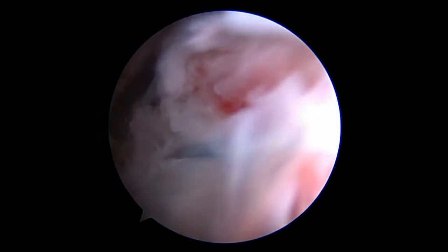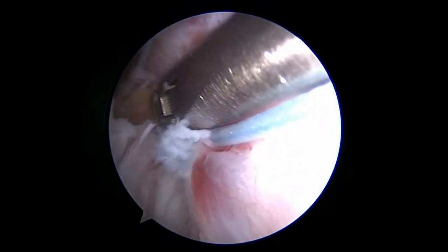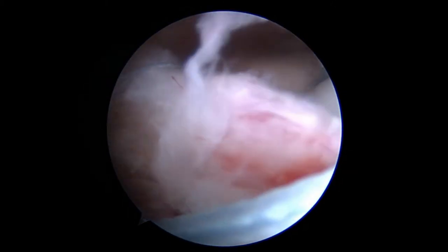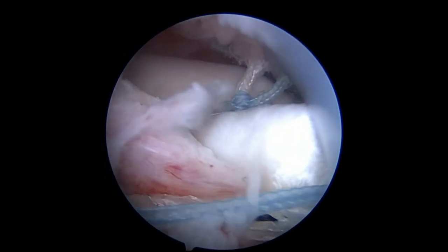The blue suture — the posterior limb from the lateral double pulley system — is passed through the residual infraspinatus, followed by the white posterior swedged fiber tapes using a scorpion suture passer. This will incorporate the infraspinatus to the speed bridge construct posterolaterally.